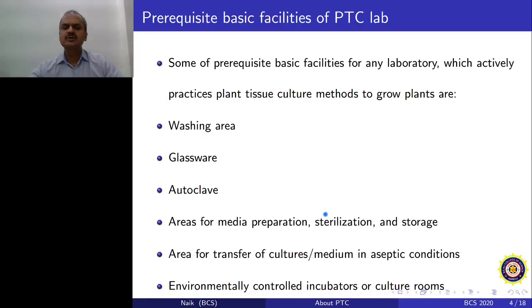But what you really do in media preparation is you have stocks which are ready, you just take them out from the freezer, and depending upon the volume of the media.